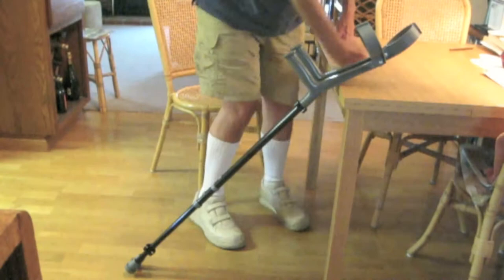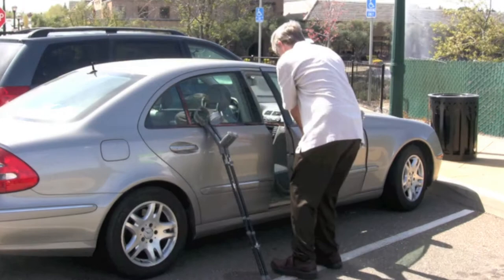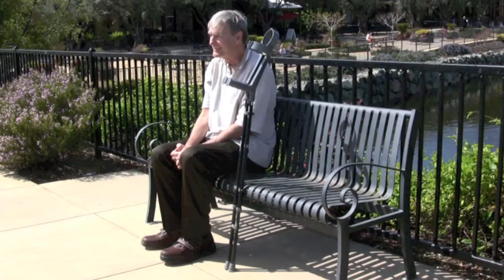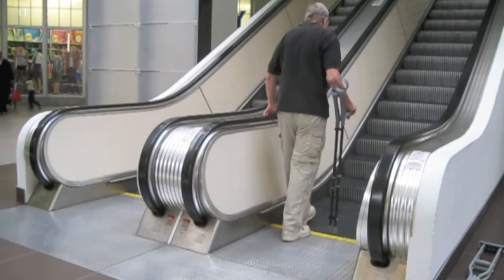Here's what the Crutch Pal can do for you. Convenience — when you need your crutches, you want them immediately. It's good to know that both of your crutches will be there where you left them, together. When the crutches are together, you get to free up one hand to do other tasks.